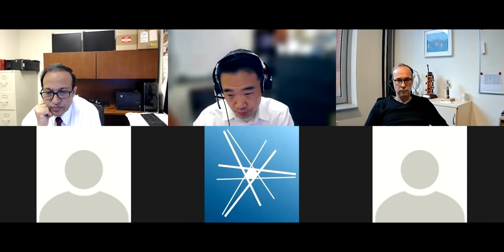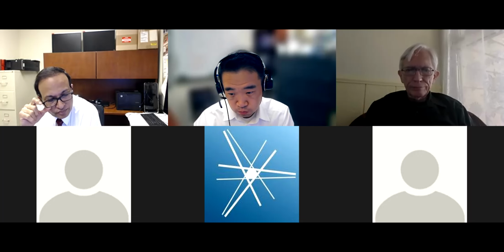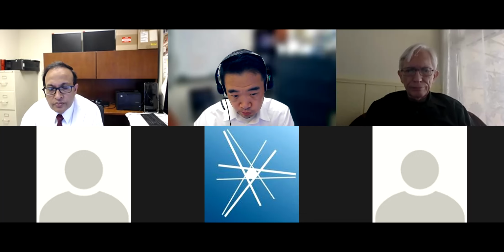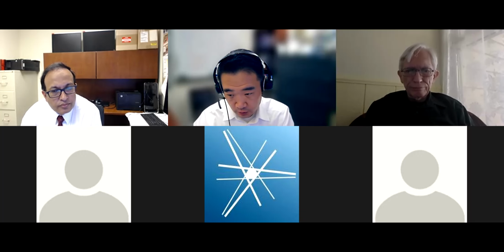But right now, we're trying to break out the brachy. We are very hopeful that 10B is in the FDA's hands right now. It's been a couple of months, so we're hoping within the next month we can get a release on it. But I'm still curious to hear more. Give me more, guys. What do you want?